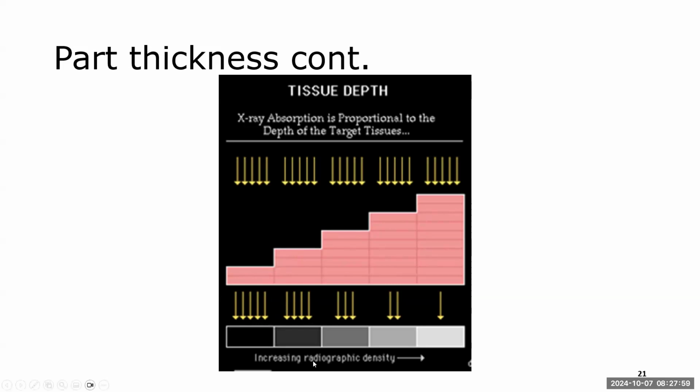Now, I know this is an old term right here, so just disregard this. This is an old picture, but I really like the picture. We don't talk about density anymore, and that was with film. That was a film term. So just disregard that. I meant to actually crop that out so that it would not confuse you.